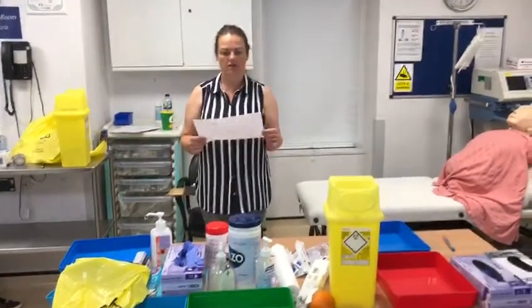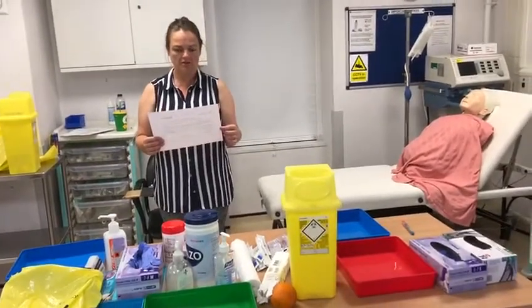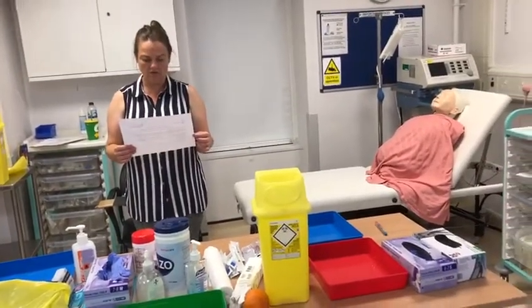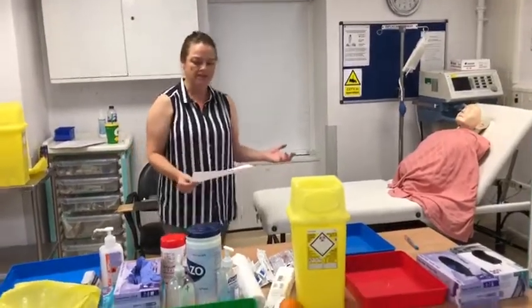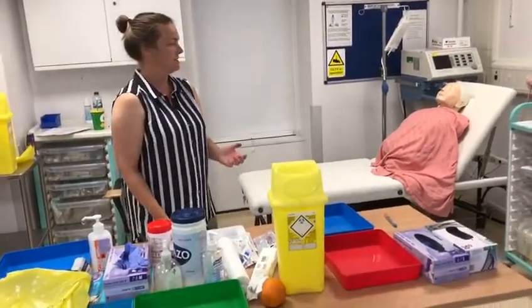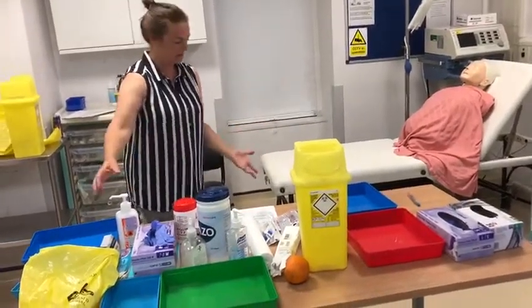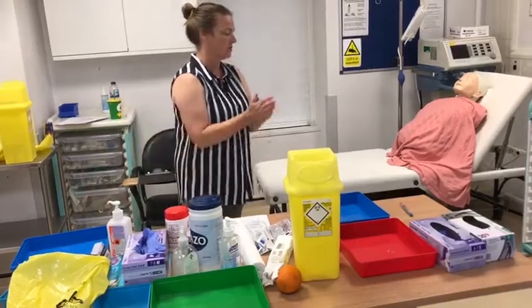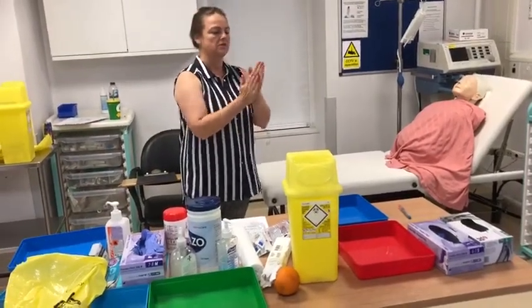We're going to go through a subcutaneous injection for the OSCE. This patient is going to be given insulin and I'm going to demonstrate how to give it in OSCE style. Safe to approach — there are no valuables, obstacles, or liquids on the floor. I'm going to do the seven steps of hand hygiene.